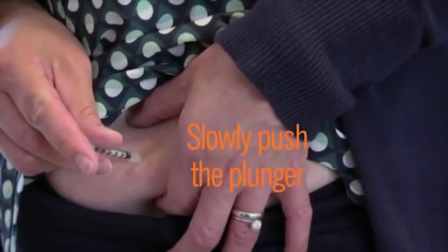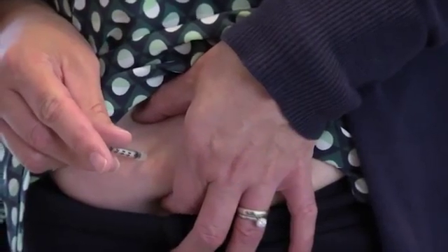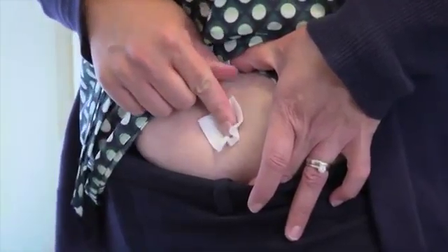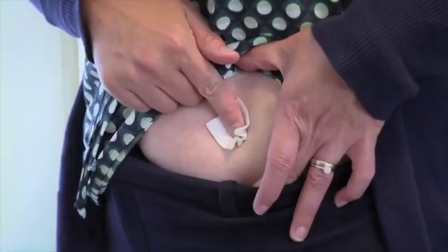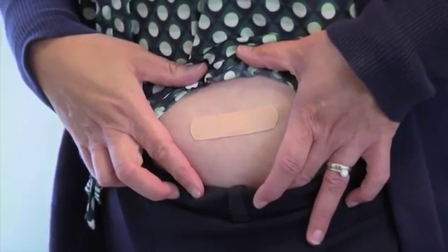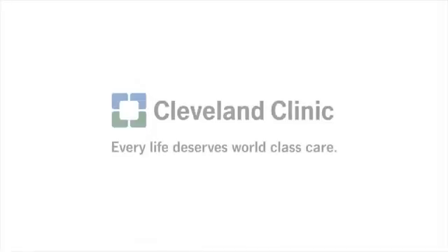Slowly push the plunger of the syringe until all of the insulin is pushed out. Stop pinching your skin and pull the needle out. You may bleed at the spot of the injection. If you notice bleeding, apply pressure with a clean alcohol wipe or a cotton ball. Cover the injection site with a bandage if necessary. Drop the entire syringe and needle into your container for used sharps equipment. Do not put the cap back on the needle.